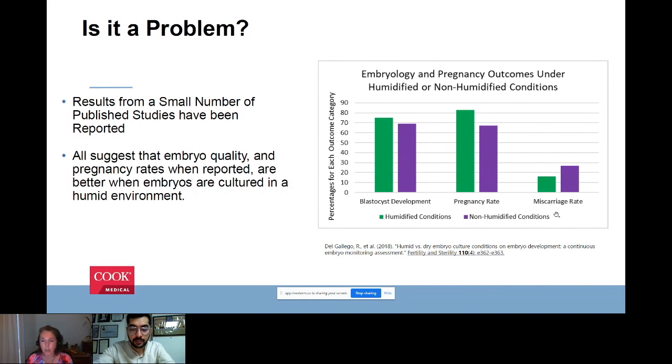and she had a higher miscarriage rate in the purple bar with about 26.5%. Another thing that she noticed is that under the humid conditions, the embryos reached the 5-cell stage earlier than in dry conditions. Because they also did a measurement on the spent culture media, she was thinking that there might be a trend of increased oxidative stress levels in the media analyzed in dry conditions. So she raised the question, does humidity improve culture stability?